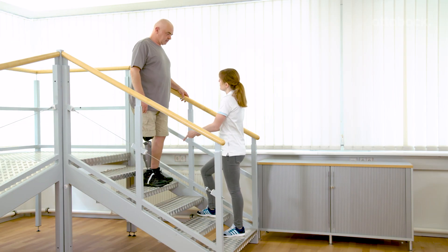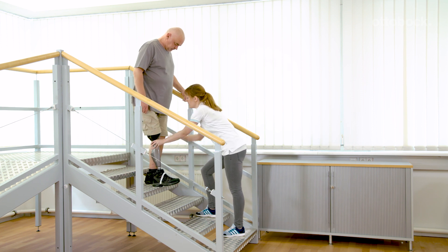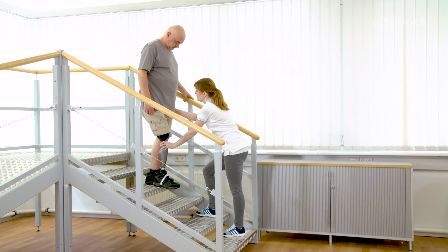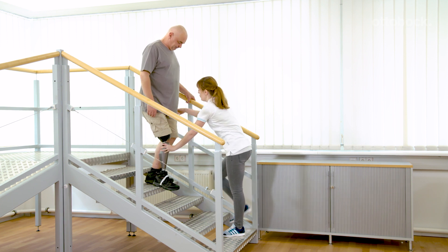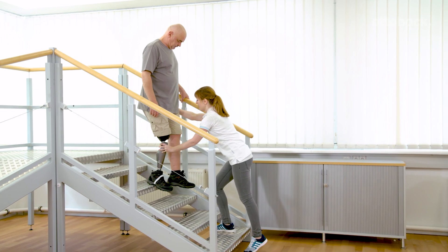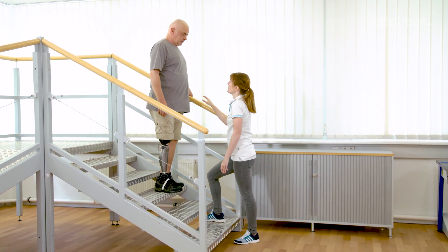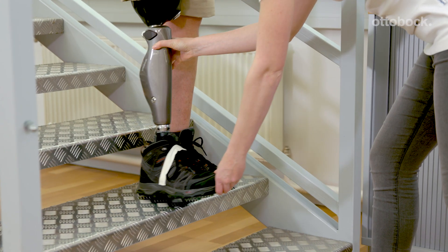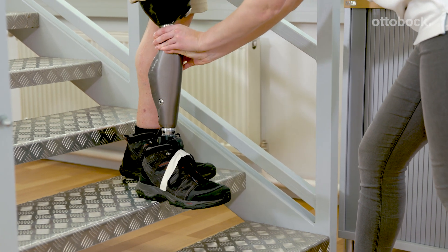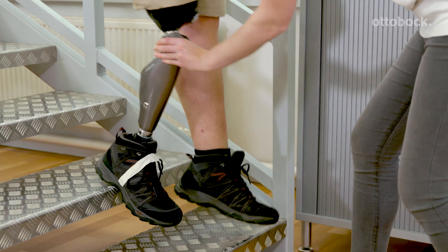Stepping down out of the intuitive stance function is practiced on the stairs. The intuitive stance function is activated by slight knee flexion and no movement of the knee. As soon as the center of mass moves forward, the intuitive stance function is deactivated. The knee joint bends against the stance flexion resistance. Franziska guides the movement of the knee joint and is therefore able to counteract residual limb extension.